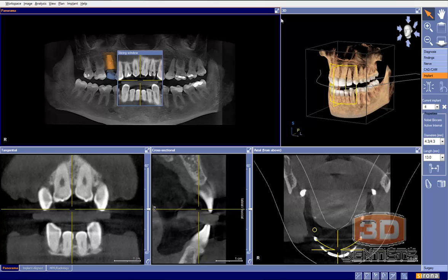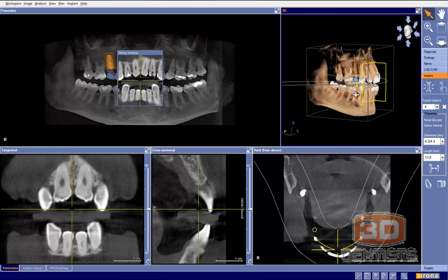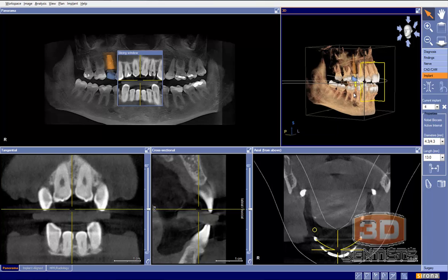Okay, we have a plan sent to us. Very common situation. Patient walks in, tooth number 4 is broken off basically to the gum line. Patient would like to have it fixed. The options are obviously endo, post, core, crown, guarded prognosis. In the event of this situation, dentist and patient both feel that taking the tooth out and looking at an immediate implant placement was the best treatment here.